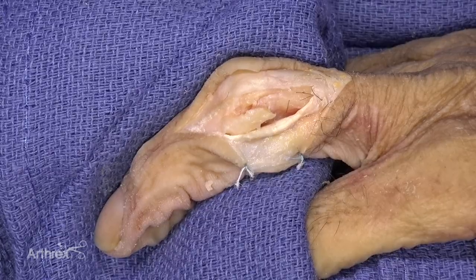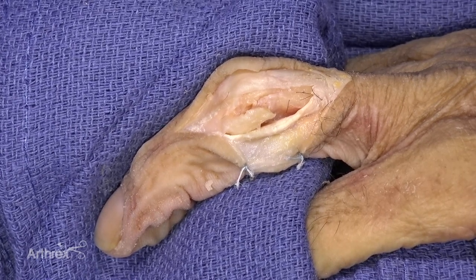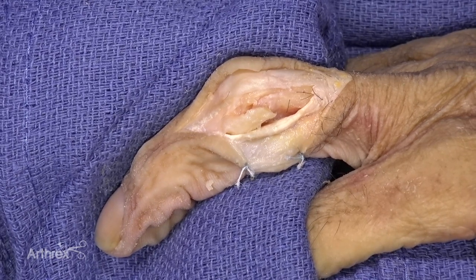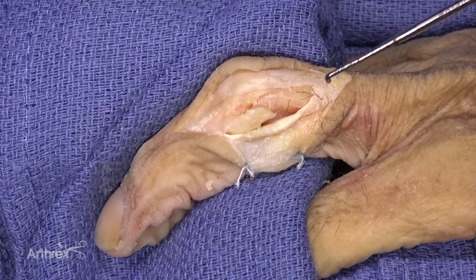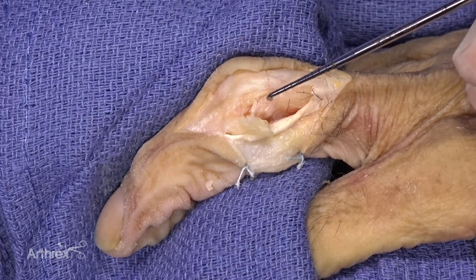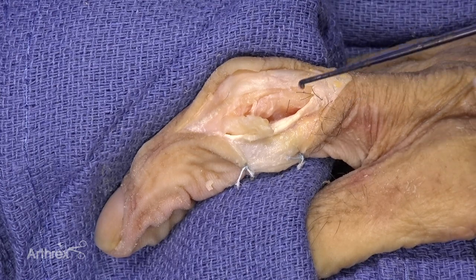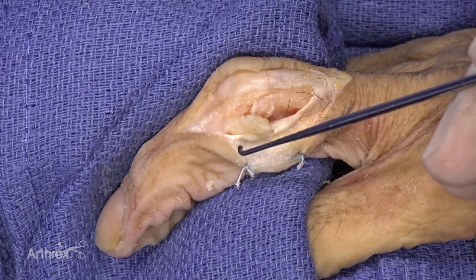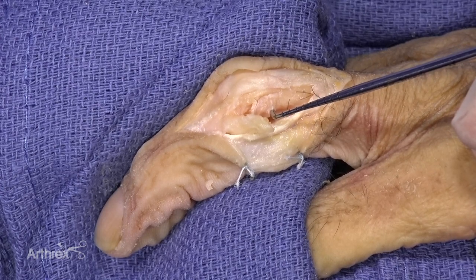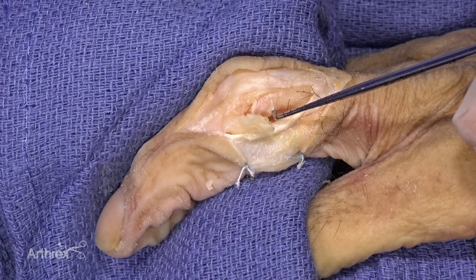So we're here today with a right hand specimen. We're going to be using the Nano Swivel Lock Anchor, the 2.5 by 7 millimeter anchor with the peek eyelet and titanium body, to fix a collateral ligament at the PIP joint of the right long finger. As you can see, we've already pre-dissected this, and the collateral ligament is now free from the proximal phalanx right here. The technique will be to place a couple of K wires across, one proximally and one distally. We're going to do an anchor proximally first. In our anchor, we're going to have a suture tape, which is 1.3 millimeters, with a 4-0 fiber wire. And we'll show you how this is done.